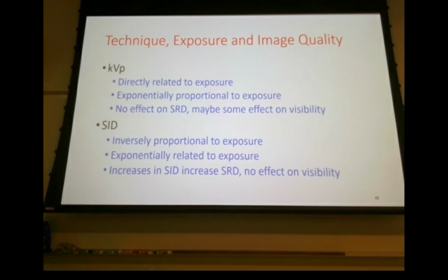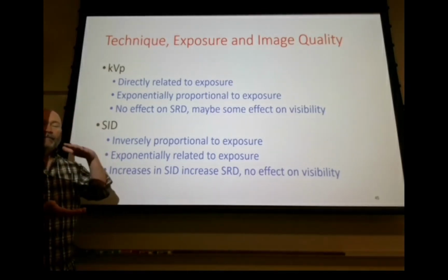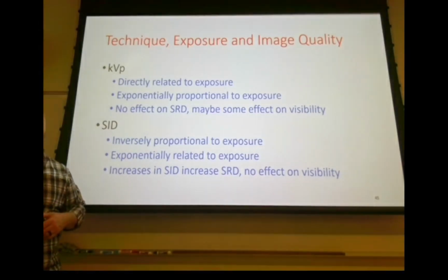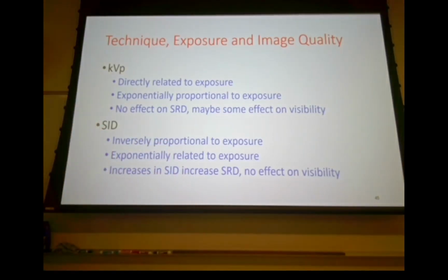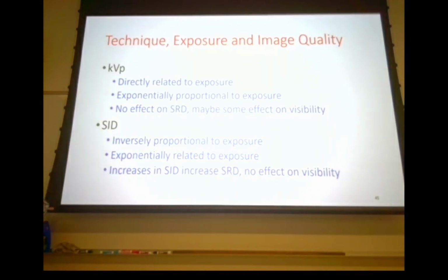And then take that same basin of water. For your first little experiment, maybe just use 2 inches of water, and then fill it up all the way to the top without spilling over, and make an exposure on that. And what you'll see then is a change in contrast, or you should see more of a change in contrast than what you see with kVp. Okay, so your tissue thickness, which is not what I meant to get into today, has more of an effect on your actual contrast than your exposure factors within a reasonable range.